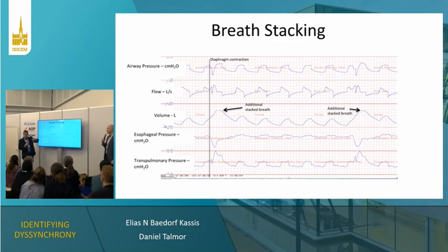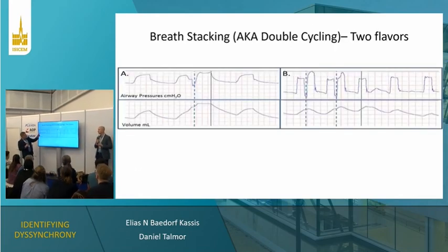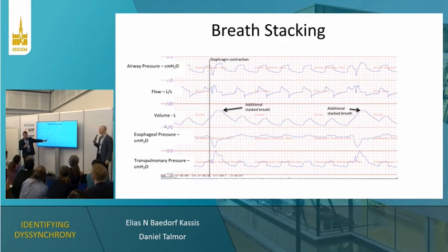Now, people are familiar with the concept of transpulmonary pressure. Can you go back just? Oh, sorry. Yeah, so he's rushing me along here. Sorry about that. So if you actually calculate the transpulmonary pressure, you have a stacked positive breath on top of a negative inflection in the chest wall. And the transpulmonary pressure, the pressure in the lung, is going to be massive. So you're at risk here not only for high tidal volumes, but high pressure on the lung as these breaths stack.